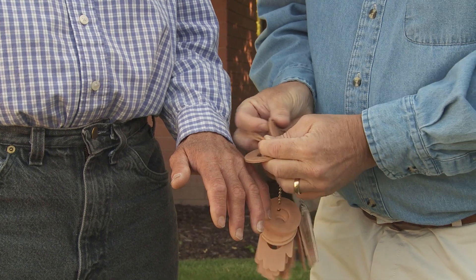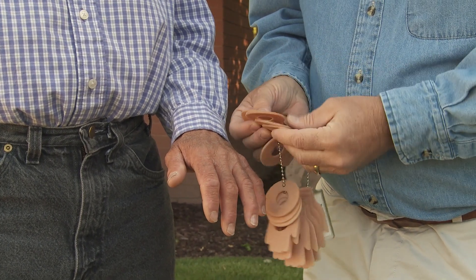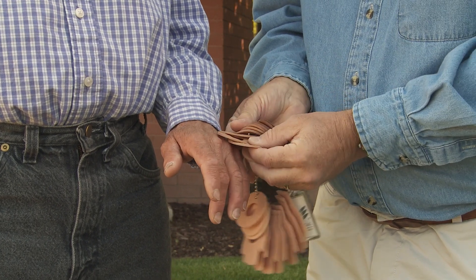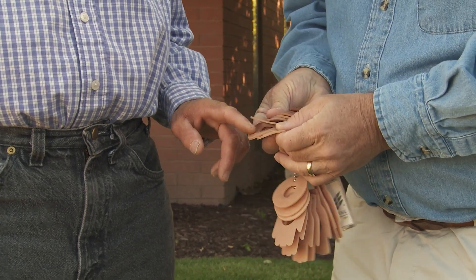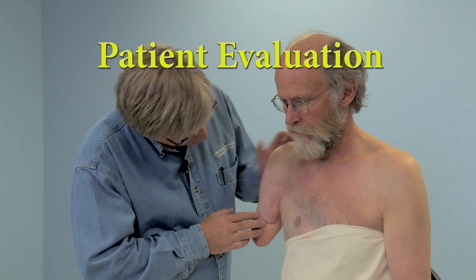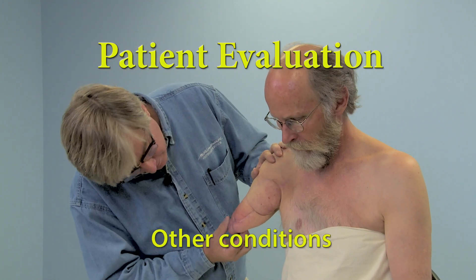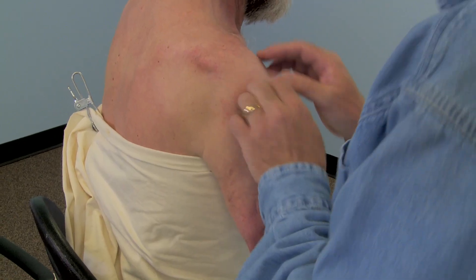If a cosmetic glove is to be used, match with a color swatch. Avoid making this determination under fluorescent lighting — outdoors is the best lighting for color matching. Examine and evaluate the patient's residual limb for any scarring, sensitive areas, skin grafting, or any other condition that will affect prosthetic fitting.